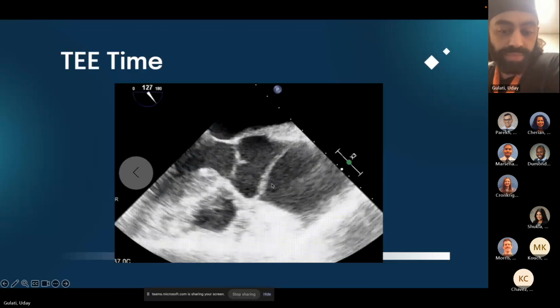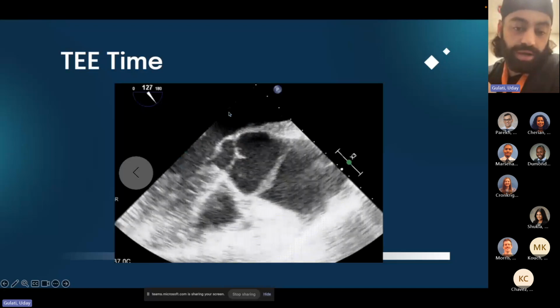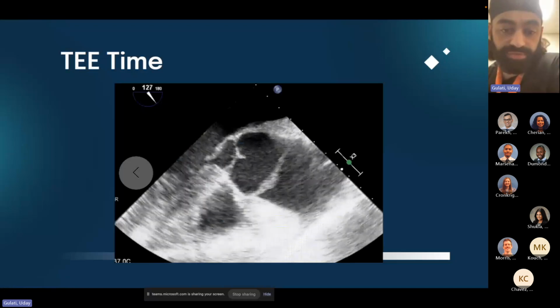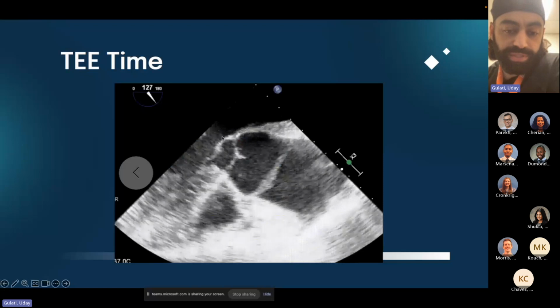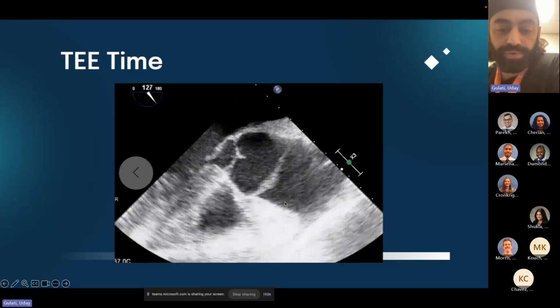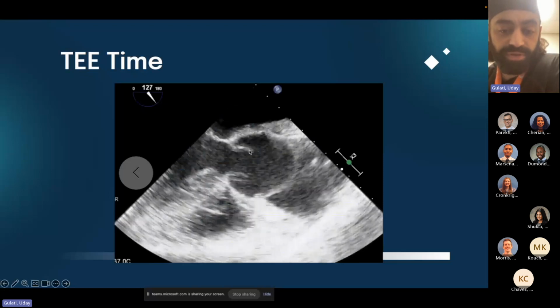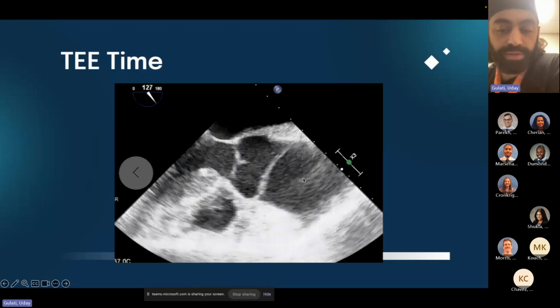And you can also visualize this by going down to the gastric, looking up, and getting a short axis view. Then, instead of spanning all the way down, you can go back up here and shoot it up this way. What you'll see is that flap kind of obscuring. And then you can see, is the flow coming out of this valve? And is there a second false lumen or not?